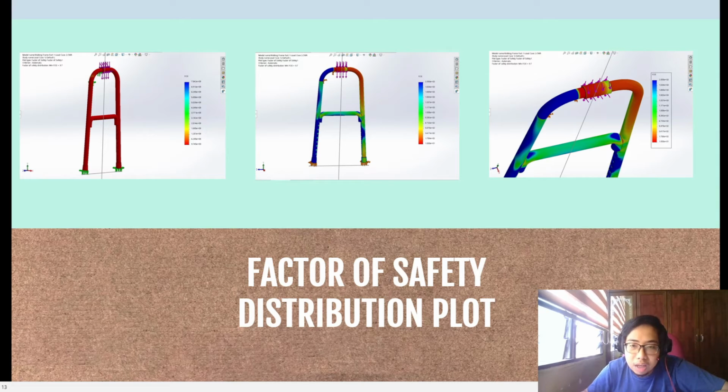For high quality mesh, the safety factor value gained from the calculation should be 10. The calculated safety factor is similar to the minimum safety factor shown in the simulation distribution plot for high quality mesh. While for the draft quality mesh, the calculated safety factor is 14.3. The simulation safety factor for draft quality is 15, which is close to the calculated value.